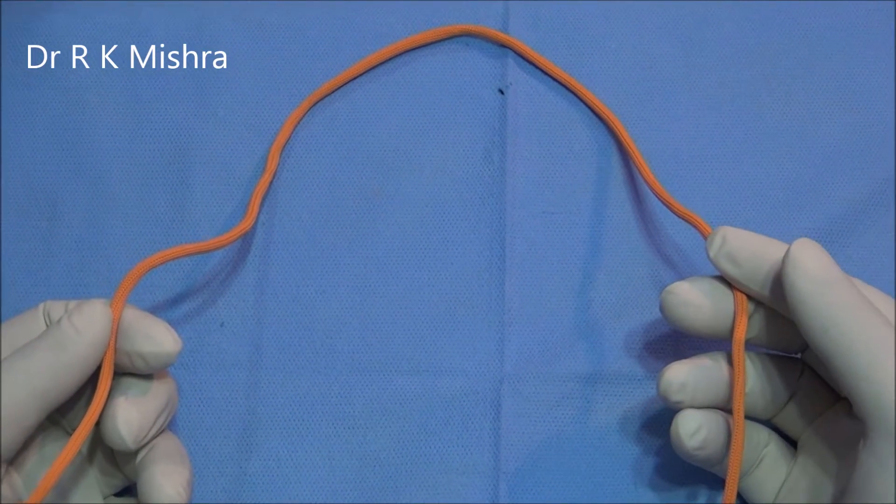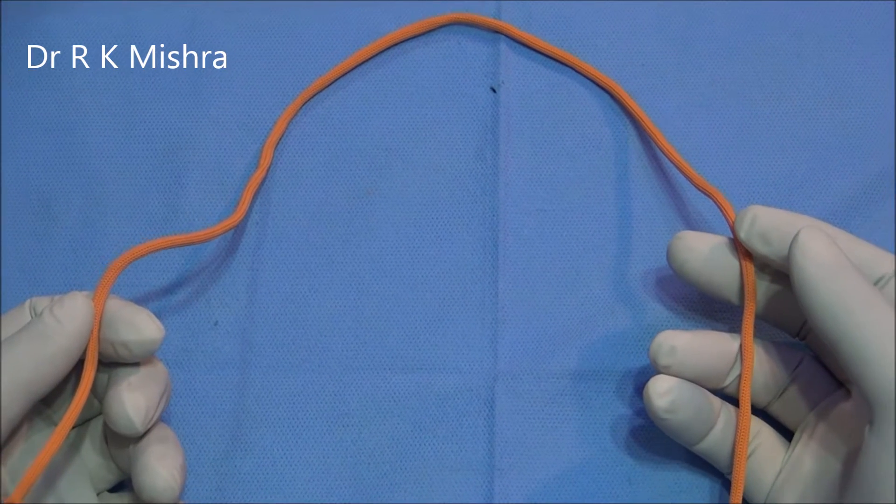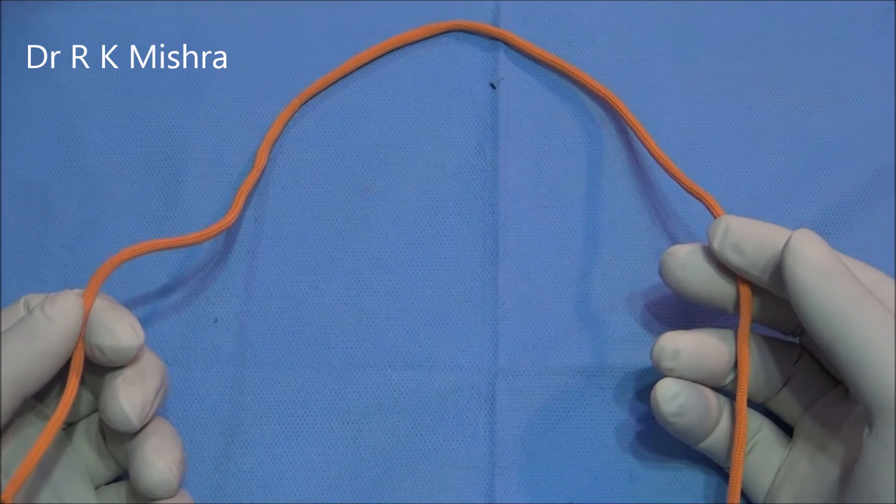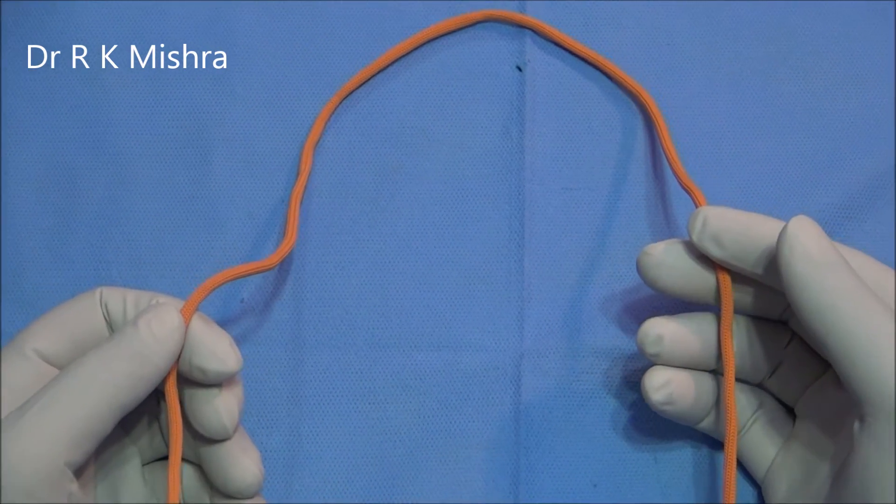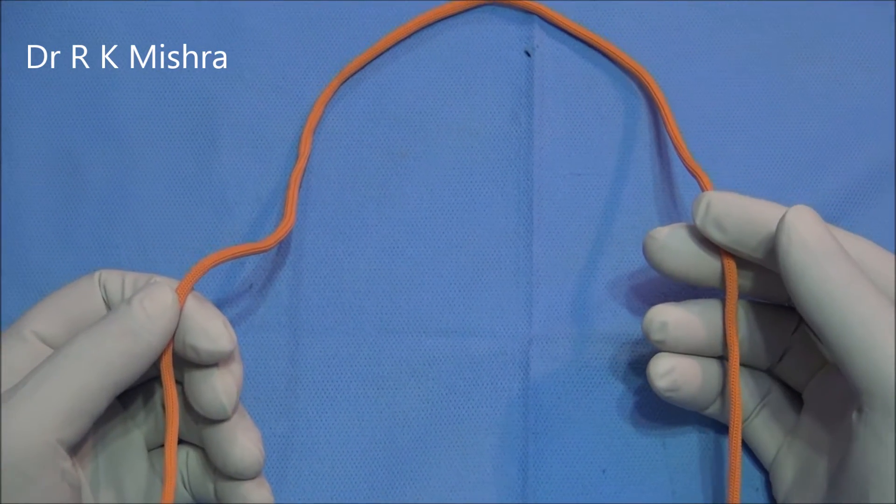How to tie the Western Knot. The Western Knot is a beautiful extra-corporeal knot. This knot can be slid without a knot pusher, with the help of Maryland.